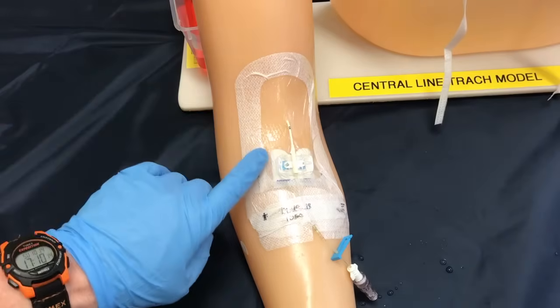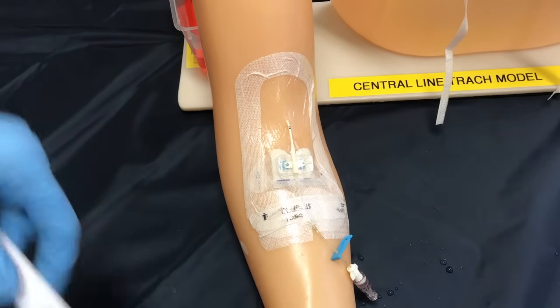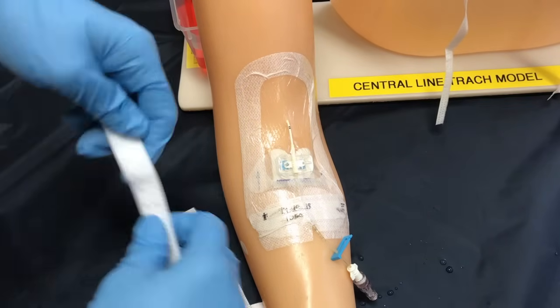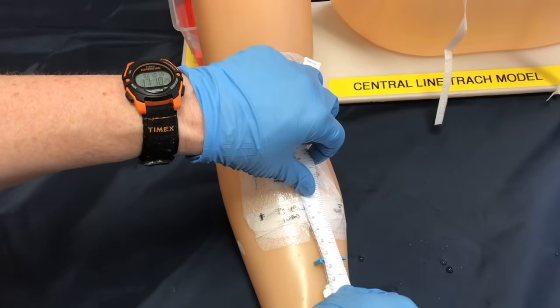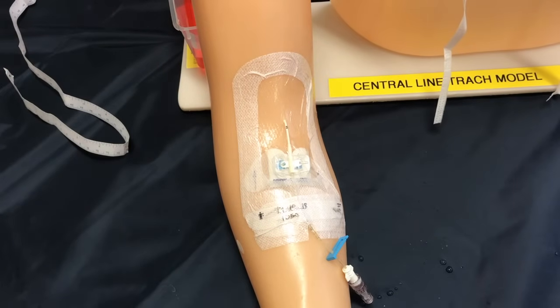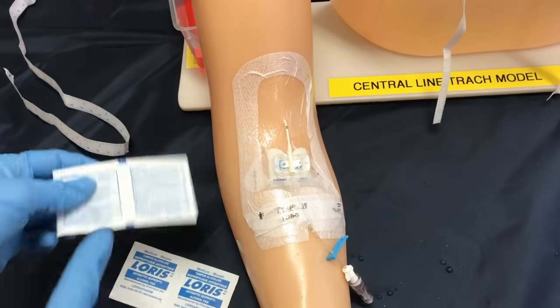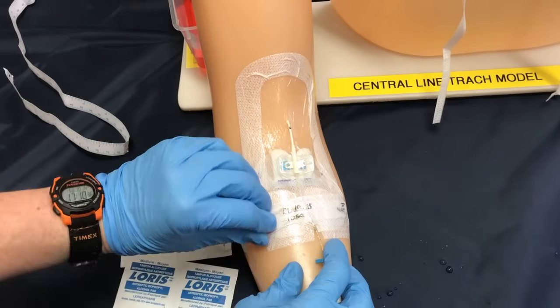With every assessment we take a look at the site to make sure that there's no irritation, swelling, or edema, and we can ask our patient if there's any pain. We're going to do a measurement — we're at 13 centimeters — so that when we're done we're also at 13 centimeters. I'm going to need my alcohol swabs and my clean gloves, and we're going to start by taking off this dressing.